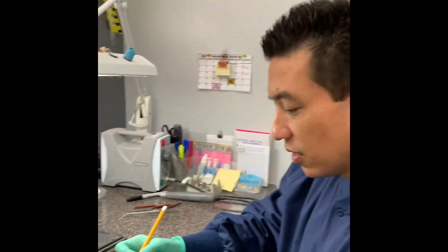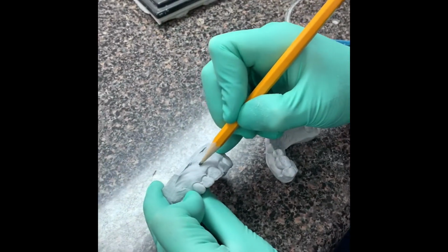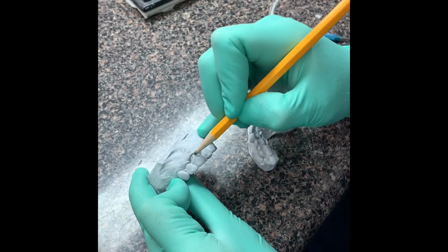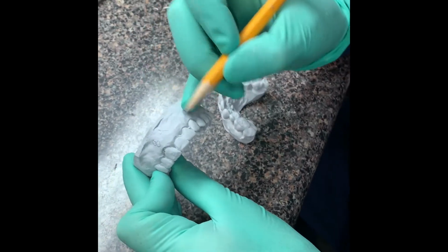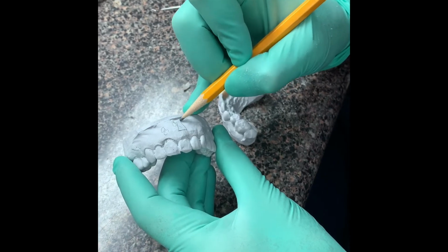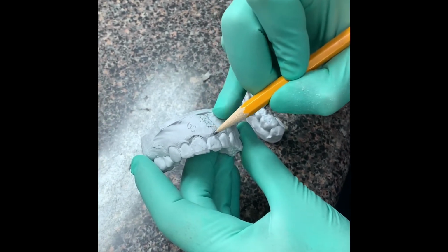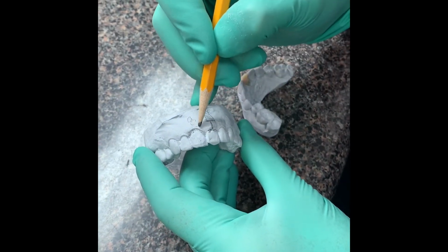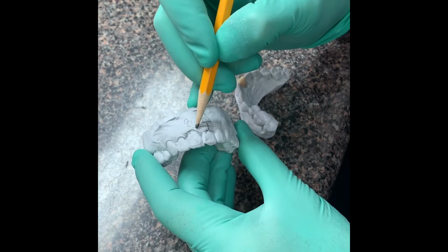We have our impression all poured up, and so we have our initial stone model. What we're going to do is knock off the cast. If you can see here, right along the gingival, this is number 8, and this is number 9. This is the gingival zenith of number 8. So we have to ask ourselves surgically, how far is the implant going to go at this level? We have to determine this distance. We know that right now the gingival zenith is here, so we have to try to replicate this, and that's where your open guide comes in.